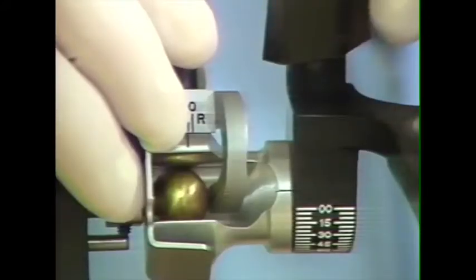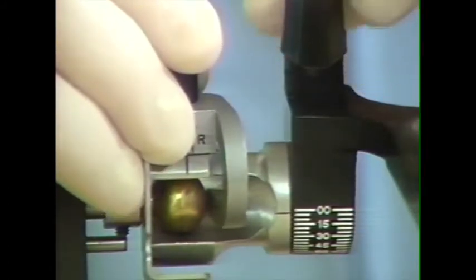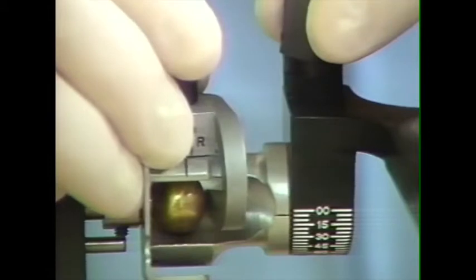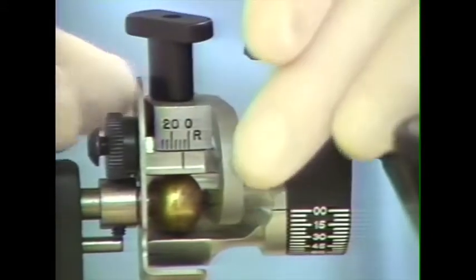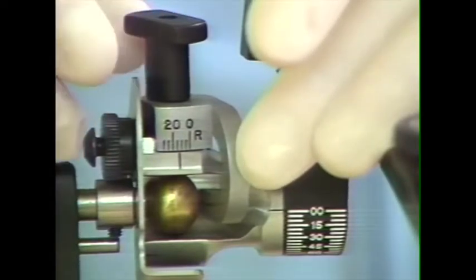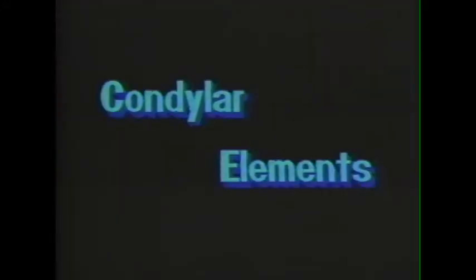The modular articulator has adjustable condylar elements. The condylar inclination can be set by loosening this knob on the top, and raising and lowering the inclination to accept the record. It also has an adjustable Bennett angle, which is adjusted by loosening the other large set screw and moving the inner wall of the condylar element inward and outward according to the record that's placed into the articulator.